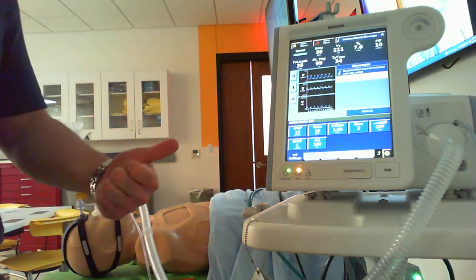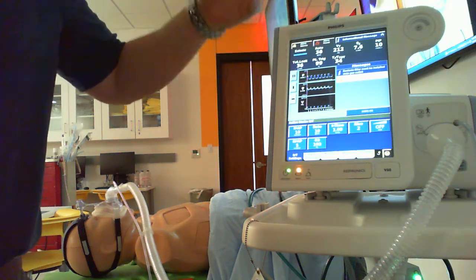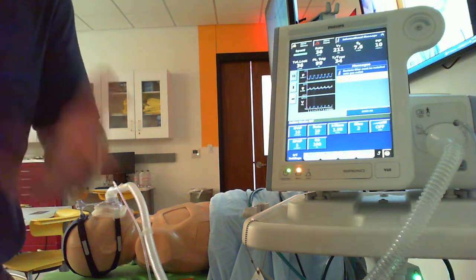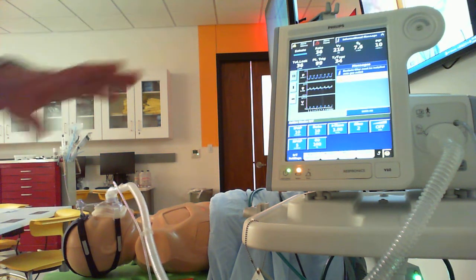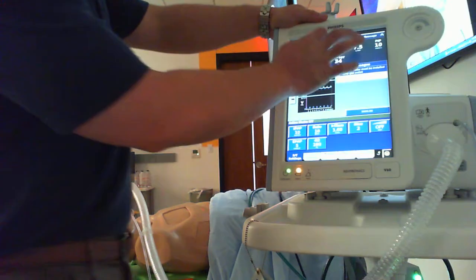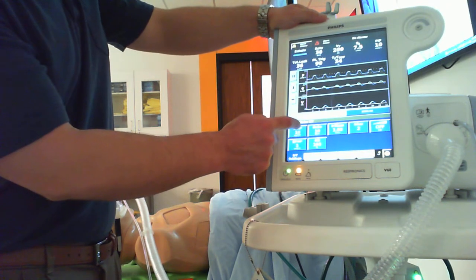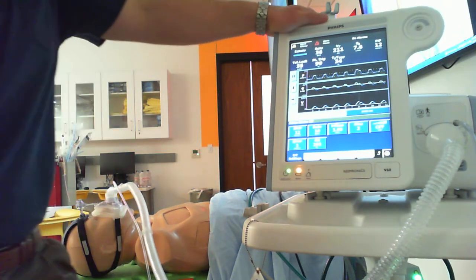Honestly, at the bedside, that is one thing, but we also want to see our patient's respiratory rate ideally less than 30, okay? It's not going to be normal, but if we can get him to drop down below 30, that's great. If we can get work of breathing looking good, or at least improved, that's ideal, all right? And we need to change pressure support to be able to achieve that, all right? So right now, I'm going to reset my alarm so you can see all my graphics here. All I'm going to do is go up on my inspiratory pressure just a little bit, okay?